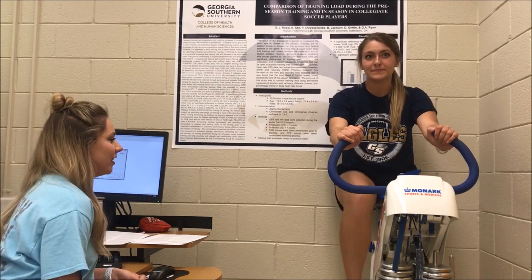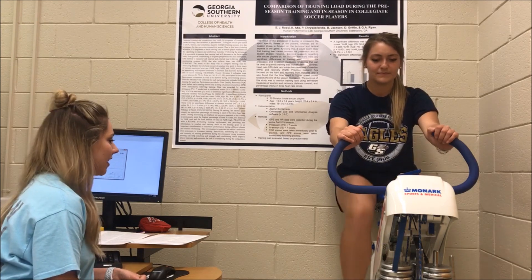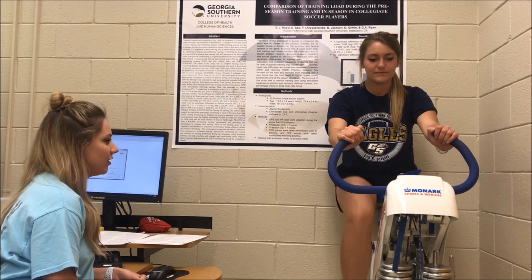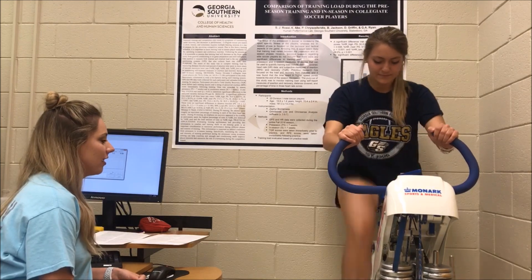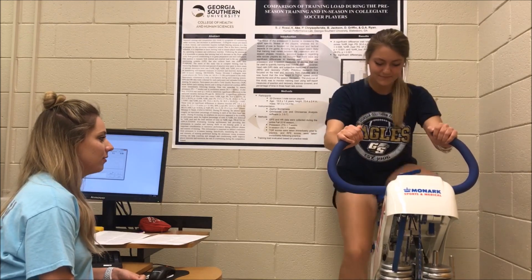Getting ready for your third all-out sprint for 4 to 6 seconds. 3, 2, 1, go. 4, 3, 2, 1.